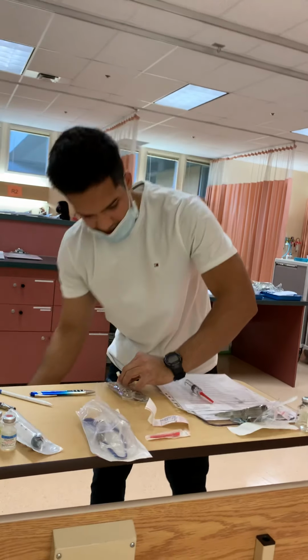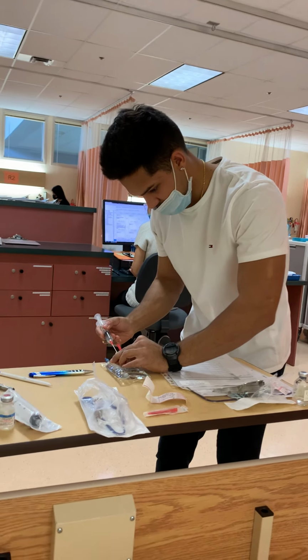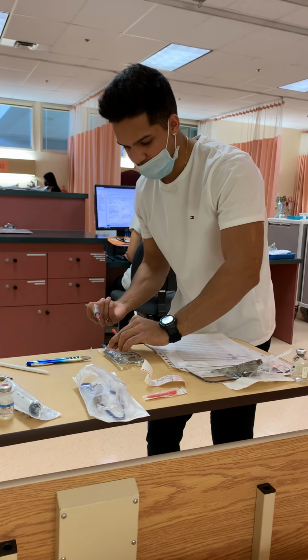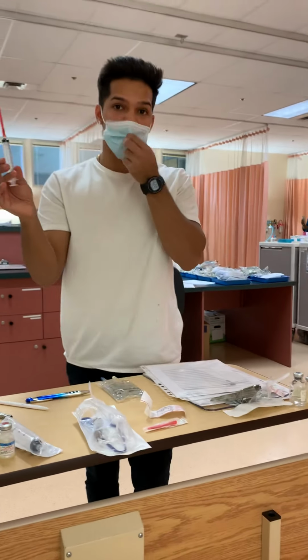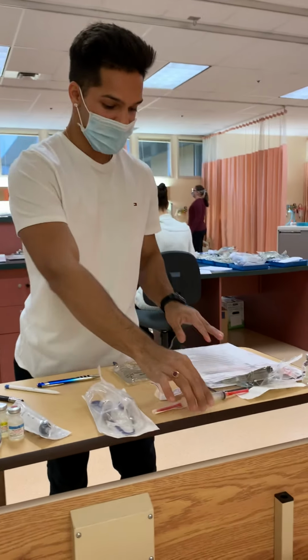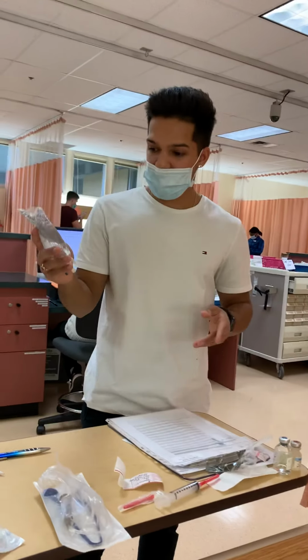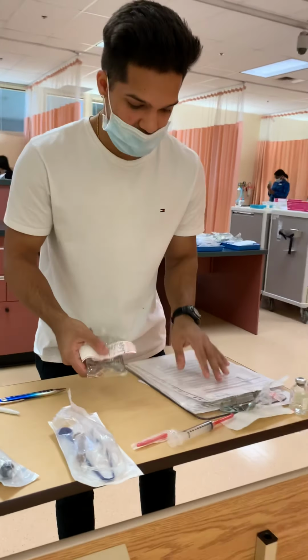Okay, once I've done that, I can take this. I can inject that into my bag. Total full 4 mLs, and I would be putting this in a sharps container, but right now I don't have a sharps container near me, so I'll just be putting it on the side. Okay, and now I can just gently swirl this around in my medication bag, make sure it's fully diluted.